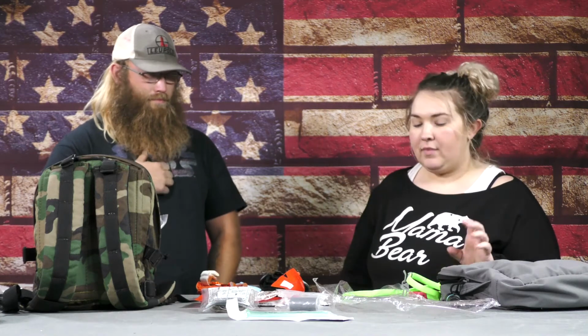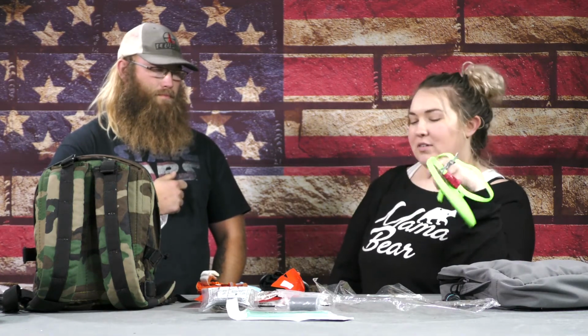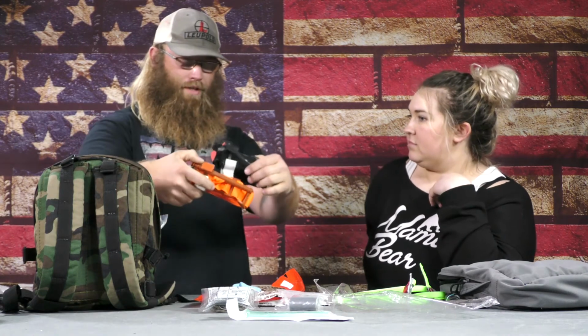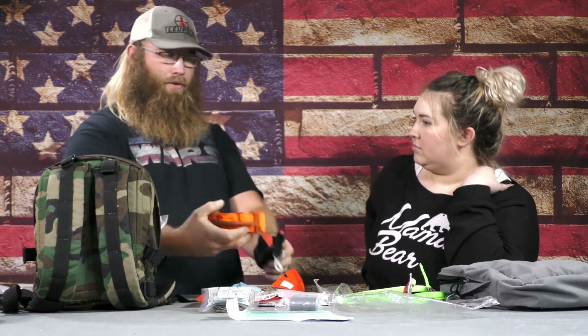RevMed makes some really good ratchet styles. But you can't beat the price. Yeah. And it works on all my kids. I think it's also fair to say you should have some windlass style, like CAT style, Recon or CAT from North American Rescue, in your bag too, just because if you had to give it to someone to use, they're most likely going to know how to use that one.